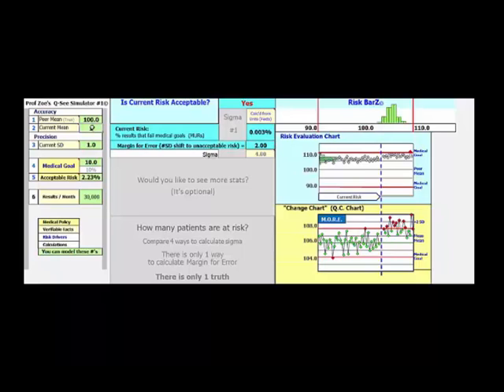And if my current mean drifts up again to 107, you can see that this method can only shift 1 standard deviation before risk is unacceptable. There are only 4 out of 20 points flagged after that shift. The odds of detecting this shift in the first run are about 25%. This is a 3 sigma method.